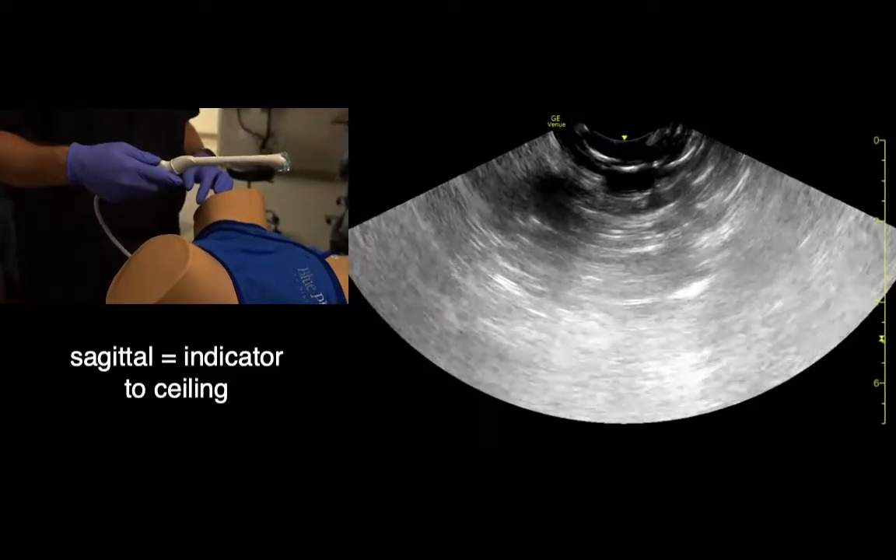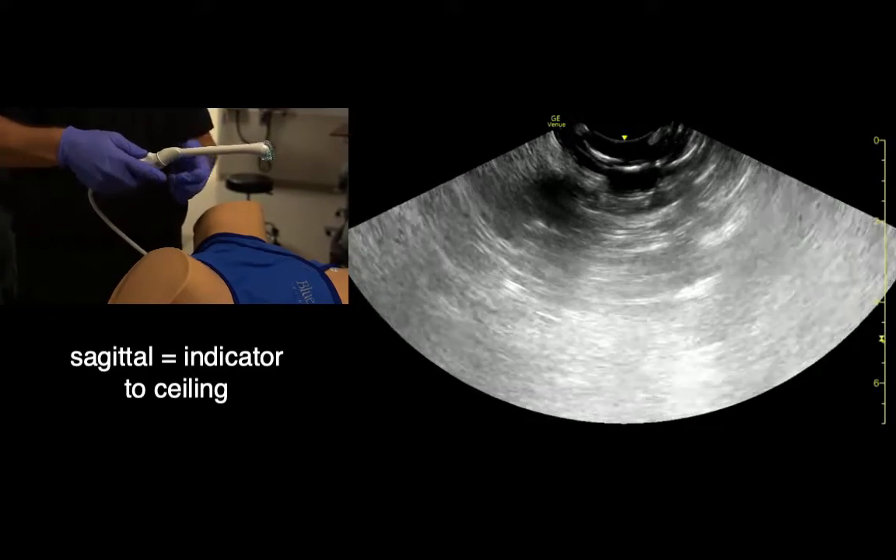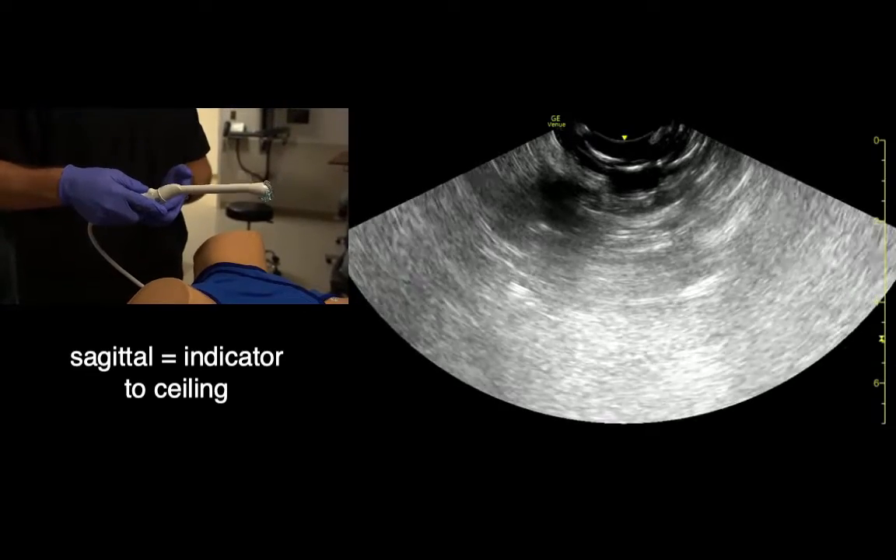For sagittal views, the probe is oriented so the indicator is on top and it looks almost like a pistol with a trigger. The trigger should be down, and this will give us sagittal views.